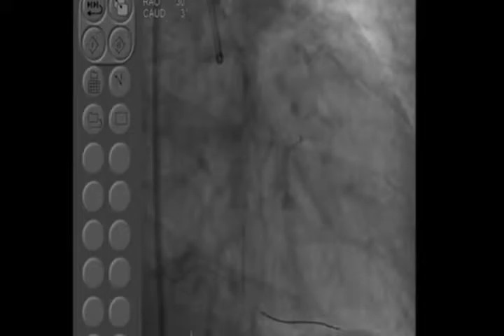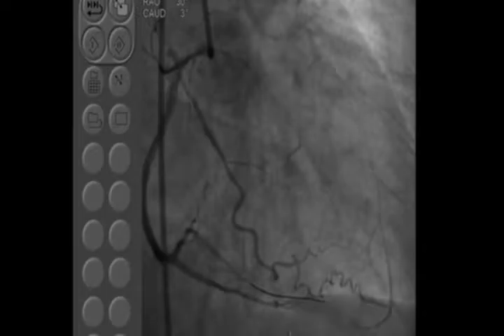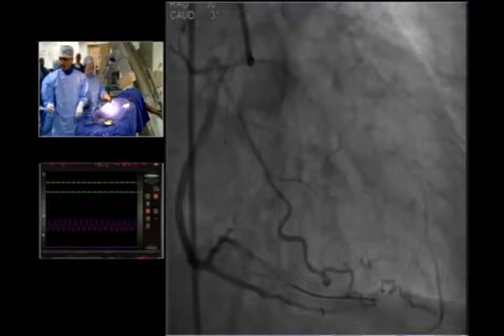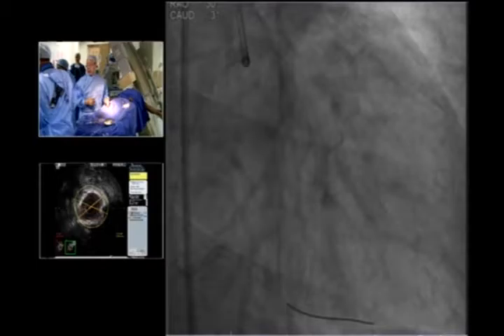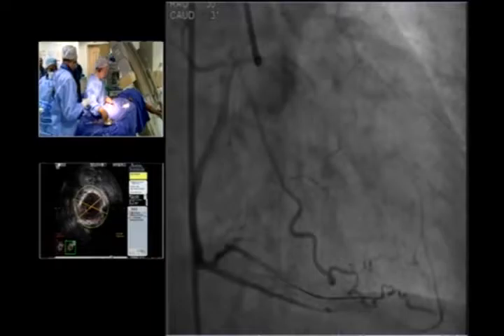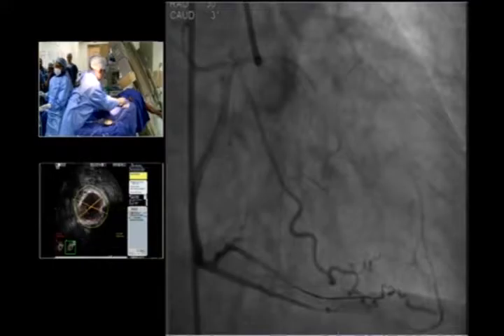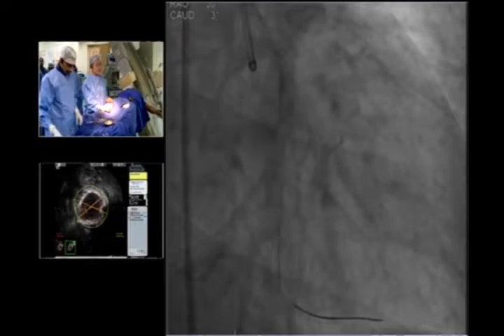How do you think? Yeah, I think the retrograde option with the epicardial is very challenging and fraught with potential for perforation. So the anterograde approach would be the preferred strategy up front. There's a lot of calcium in that LAD as well. We haven't seen the LAD shot yet. Yes, heavily calcified. Can I have the left EBU guiding? Left main, yeah. 3.5? 3.5. Yep, 7 French EBU 3.5. Okay, I will put the guiding. So flush.